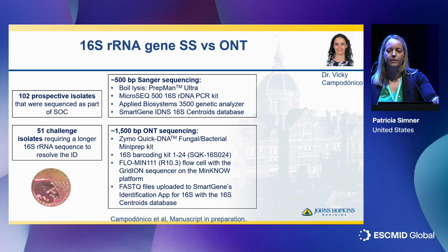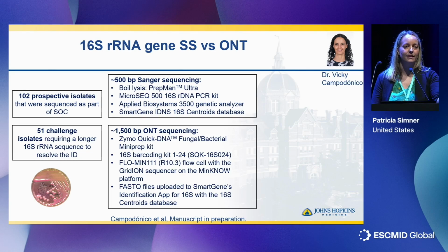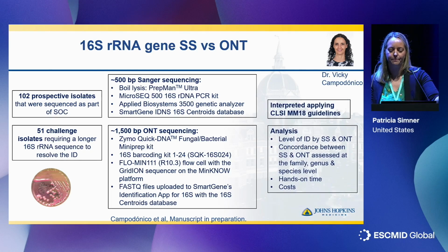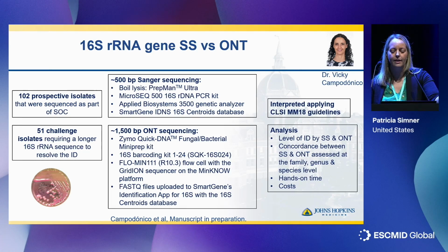We were working closely with SmartGene on this study, where they were helping us develop their 16S app for this nanopore-based data, utilizing the Centroids database for interpretation. We applied the CLSI MM18 guidelines for interpreting the 16S results, as we would for Sanger sequencing for patient care, and then looked at the level of identification that we were getting between Sanger and nanopore sequencing, the concordance of those identifications, the hands-on time, and costs.